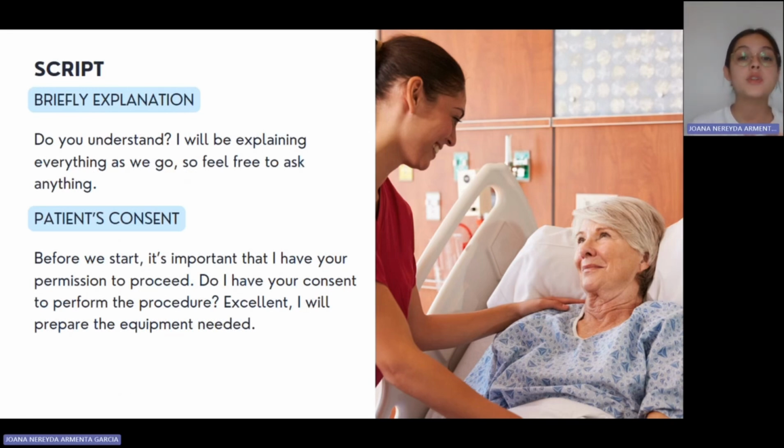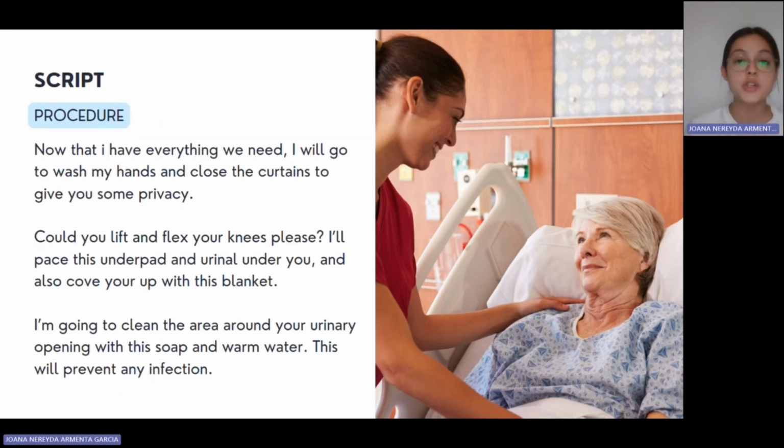We'll ask for the patient's consent. Before we start, it's important that I have your permission to proceed. Do I have your consent to perform the procedure? If they say yes, excellent. I will be preparing the equipment that we need. Now for the procedure itself.